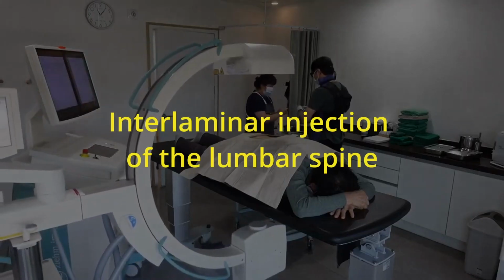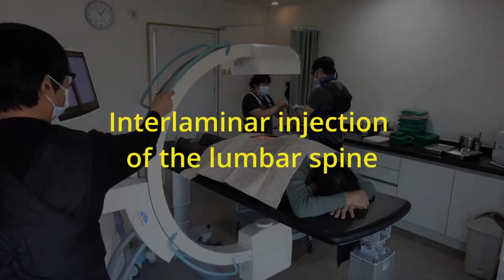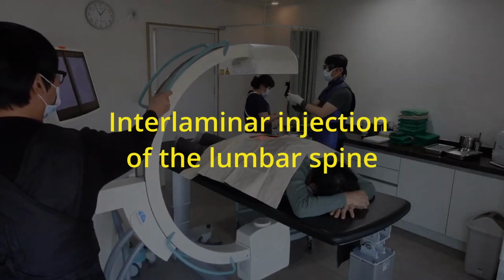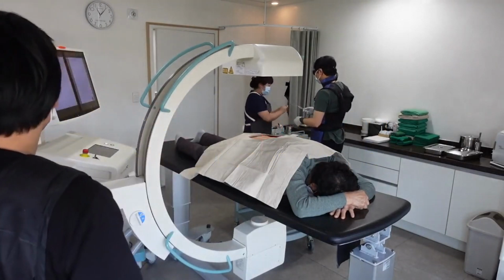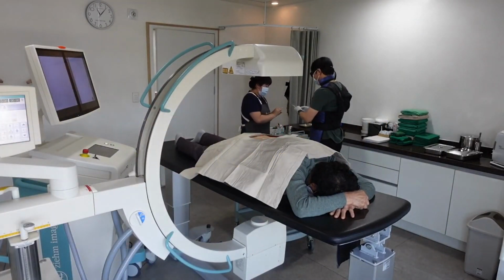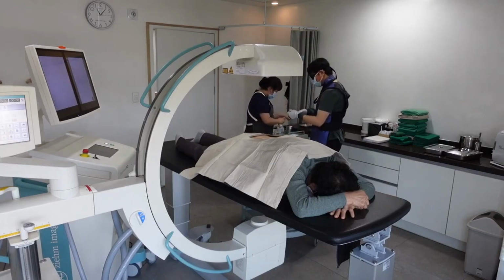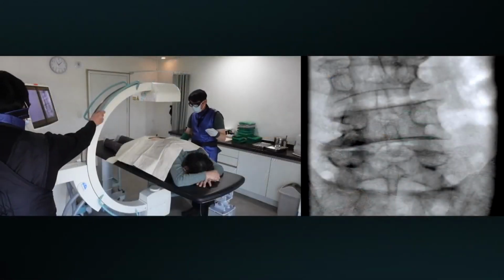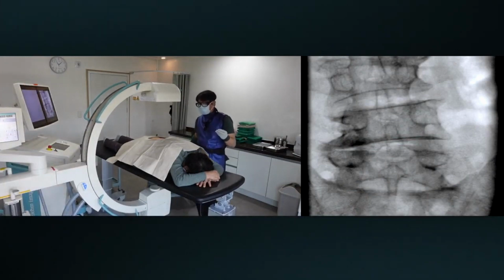The next demonstration is on the technique for a lumbar interlamina epidural injection, utilizing AP and contralateral oblique C-arm image guidance. Many doctors tend to insert the needle under AP image guidance and verify the final needle position using a lateral C-arm view. Recently, I have seen more experts appreciate the advantages of a contralateral oblique image, a technique I introduced on my YouTube channel.